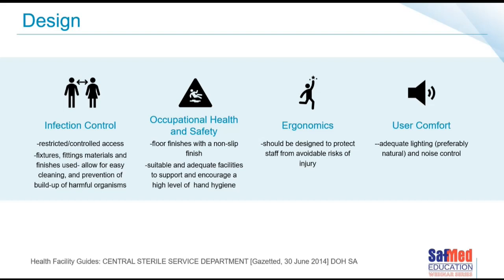Occupational health and safety. The finishes on the floor need to be non-slip. It's a wet area often in the dirty side of the CSSD. We need suitable and adequate facilities to support and encourage high levels of hand hygiene.